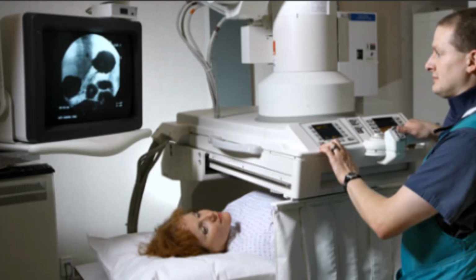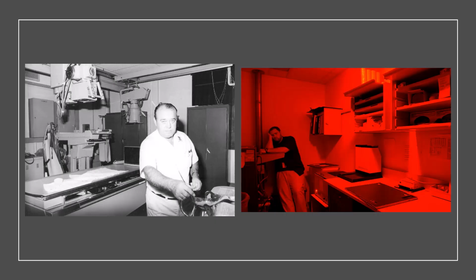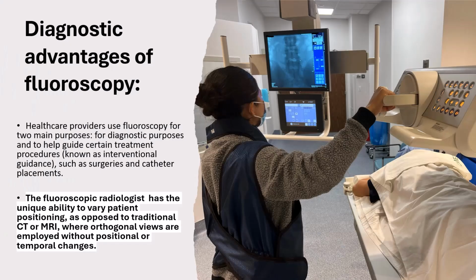This is believed to be due to the availability of other imaging procedure options for diagnosis, such as CT and MRI. While the use of fluoroscopy for diagnostic purposes has decreased, its use for image guidance during procedures has expanded dramatically. This is because fluoroscopy allows for real-time imaging, making it particularly useful for guiding interventions and surgeries.